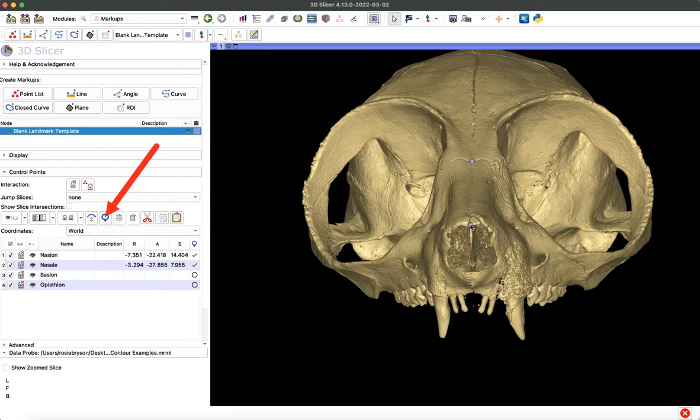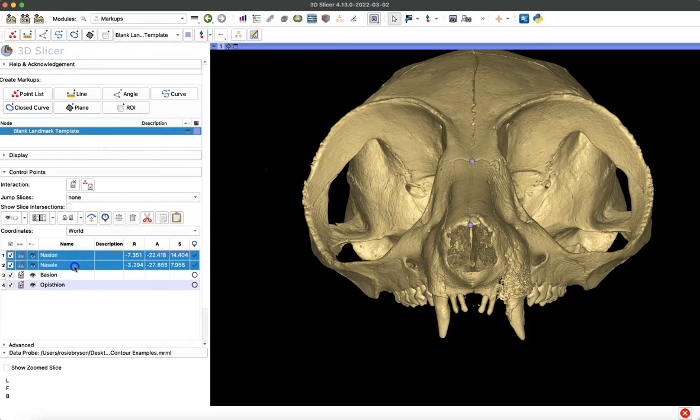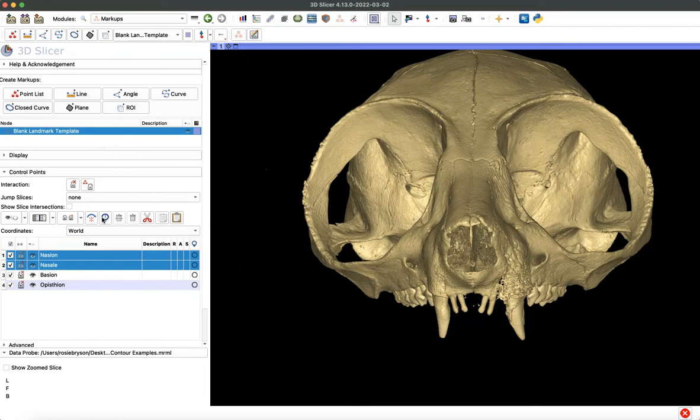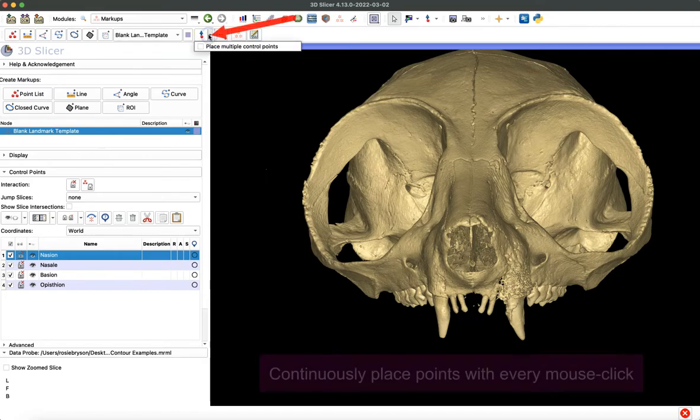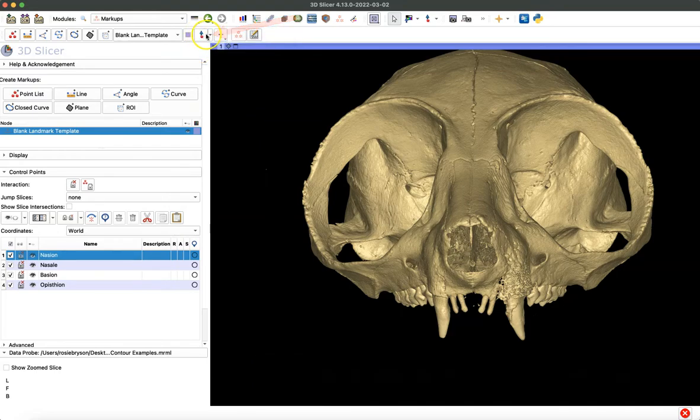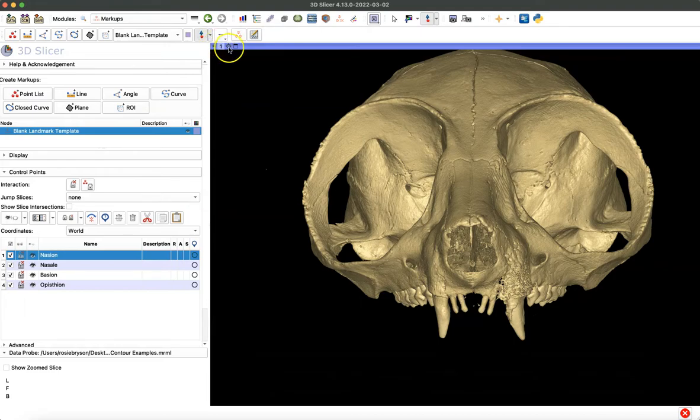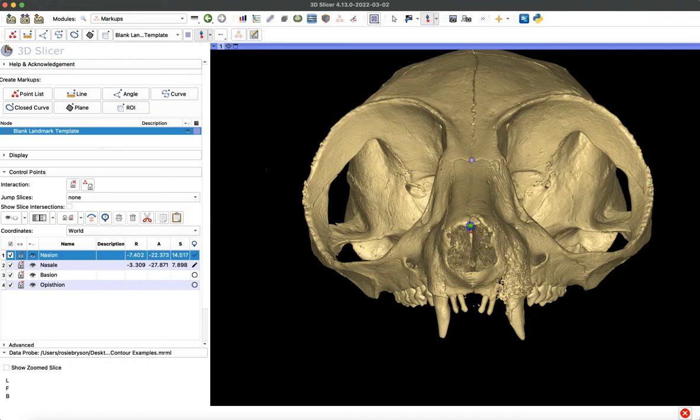If you make a mistake and want to delete those coordinates without deleting your landmark list, you'll click this icon to clear your points. I select nasion and nasale and click that icon. If you want to continuously place landmarks every time that you click, you can select this dropdown arrow next to our landmark placing icon and select Place Multiple Control Points. Now the first place that I click will be nasion, and then immediately my next click will be nasale.